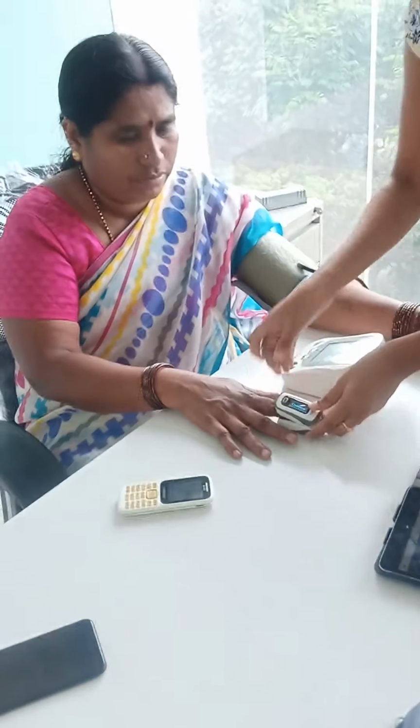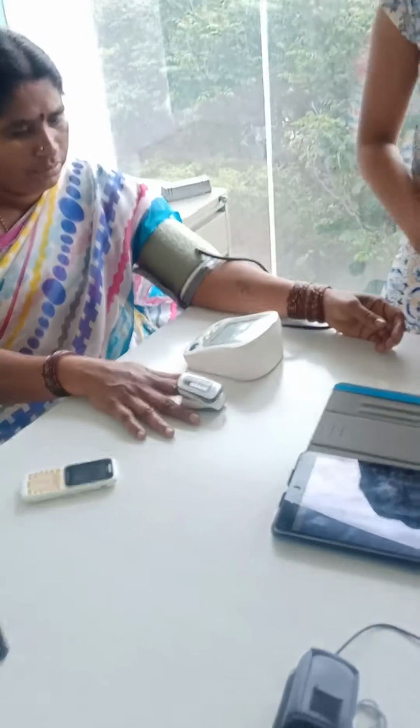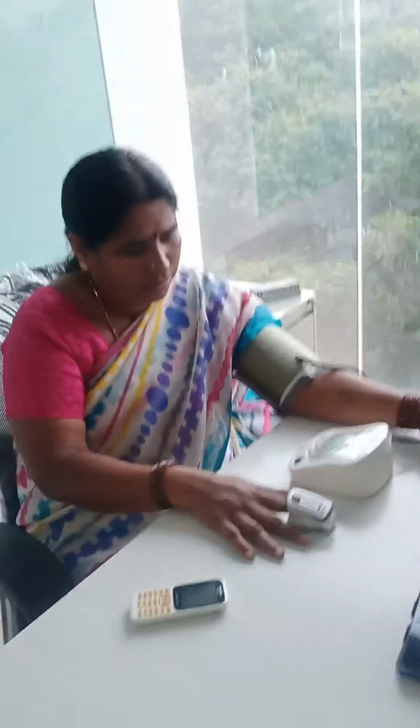The blood pressure and pulse oximetry can be done at the same time, and you should see the data flowing in instantly. Yes, we've got it. You can see the heart rate and the percentage of oxygen in the blood has been registered automatically.